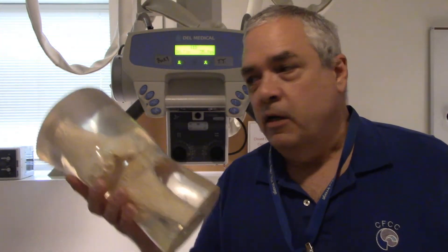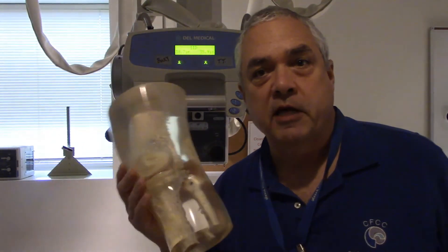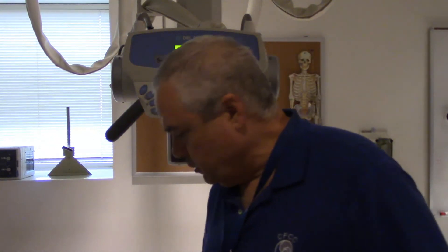We're going to take this phantom and we're going to put it on the table because we're going to be using the table bucky for this. Remember, this phantom is more than 10 centimeters in thickness, and anytime we have more than 10 centimeters, what do we need? A grid of some sort. Never shoot thick anatomy without a grid. Your images are going to look really bad. I'm going to put this on the table, we're going to make some exposures at 58 kVp and we're going to see what these images look like.